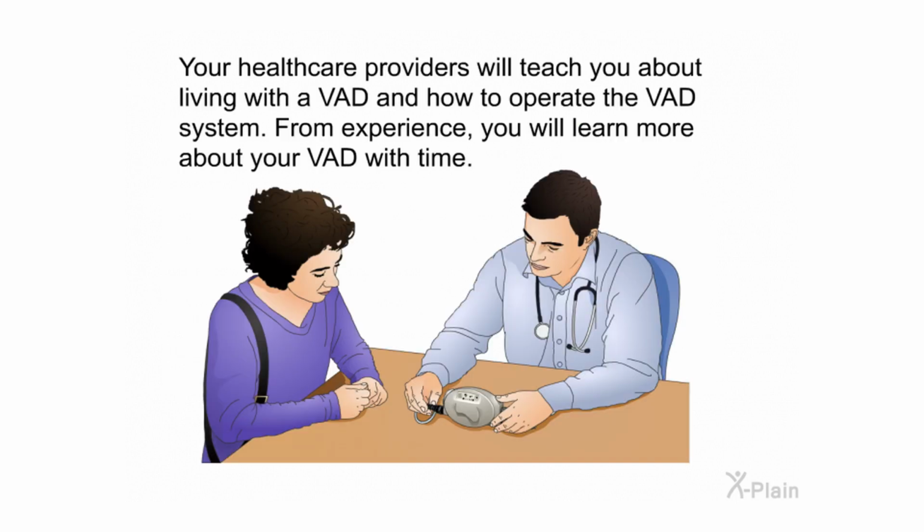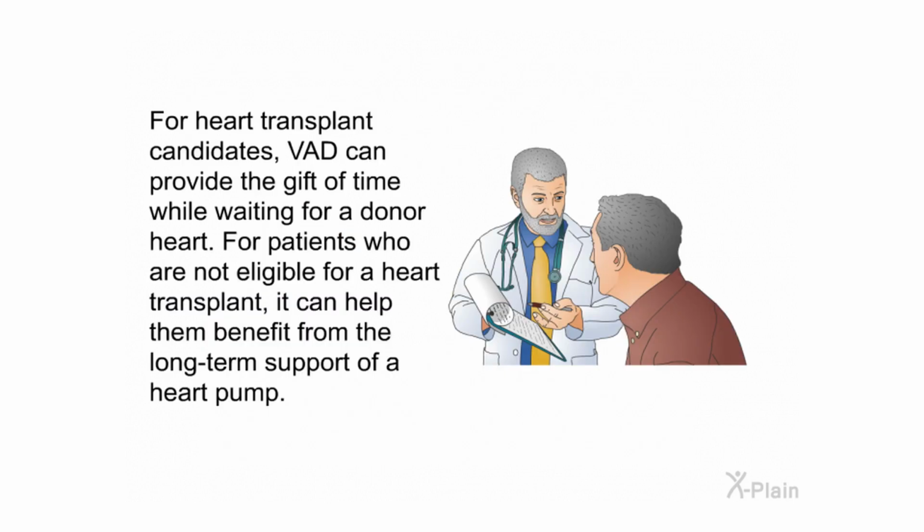Your healthcare providers will teach you about living with a VAD and how to operate the VAD system. From experience, you will learn more about your VAD with time. For heart transplant candidates, VAD can provide the gift of time while waiting for a donor heart. For patients who are not eligible for a heart transplant, it can help them benefit from the long-term support of a heart pump.